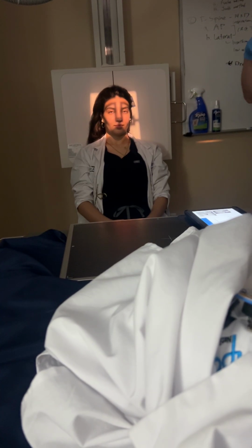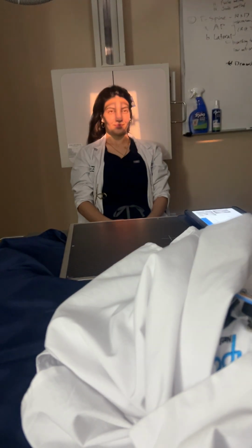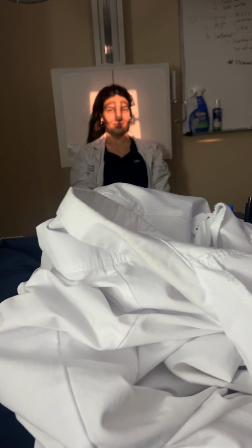And that's with that flat piece right here on the board, right? I know you want to punch me. I know it's okay. You know what I'm talking about. No? I have the infraorbitomeatal line perpendicular. Well, that's what I mean. Yes, I know that, but it's like that flat piece. I don't even know what the flat piece is, April. It's a piece of your skull, and it has a name, but I just don't know. Were you left on your back too much as a baby? Okay, Nora, I'm sorry. You can relax.